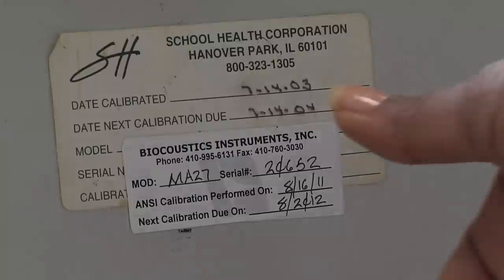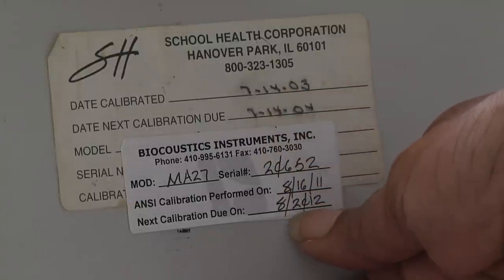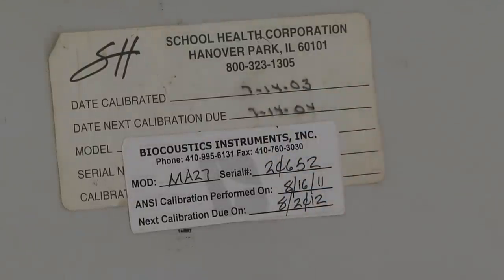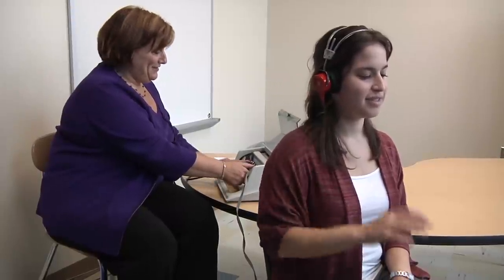In addition to daily listening checks, it is important that the equipment be calibrated by a professional testing facility at least once per year. The date of the last calibration check should appear on the audiometer or be available from the calibration file from the school system or health department. If you do not have normal hearing, ask an adult with normal hearing to help you do a brief listening check: first do a hearing screening on the listener, then put on a continuous tone and ask the listener to let you know if they hear any unusual sounds as you move the cords.